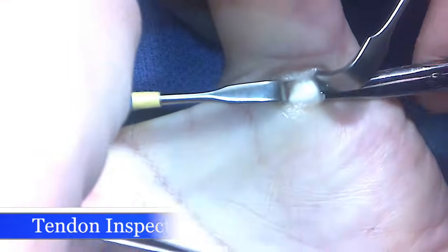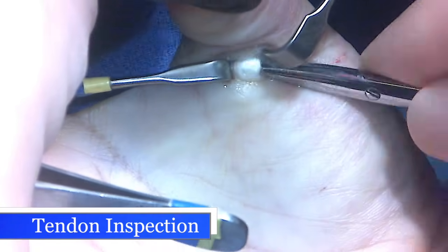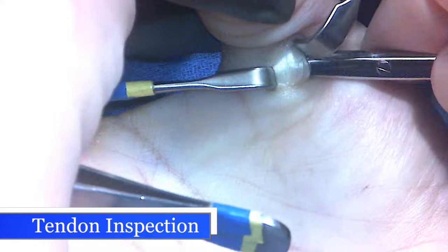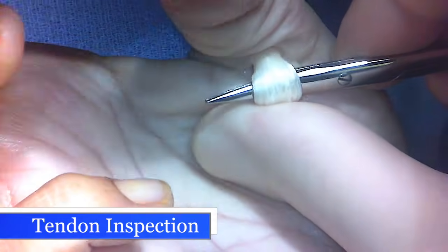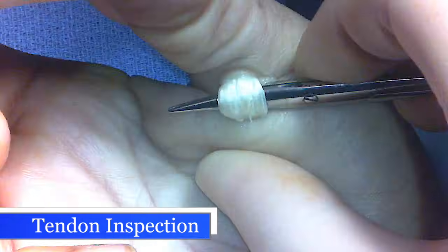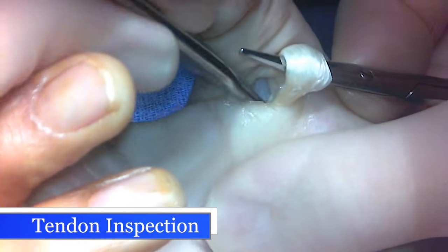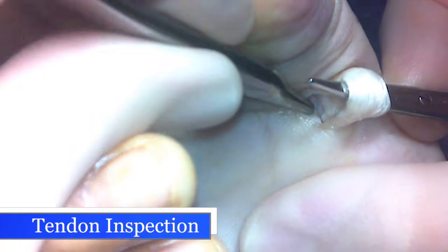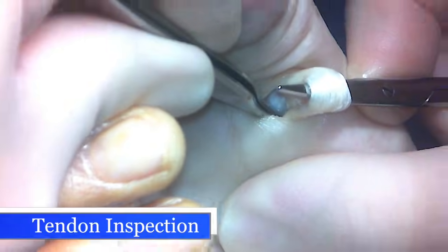Now I've completed the division of the pulley. I'm going to gently tug on the flexor tendon to the thumb and pull this out of the thumb. It allows me to move the thumb and make sure there's no further snapping, and it will also allow me to inspect the lower surface of the flexor pulley sheath that you're seeing there, deep to the wound.